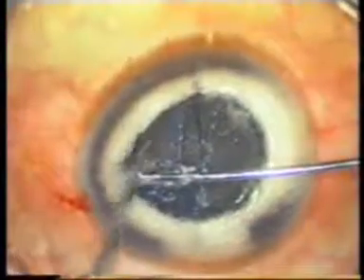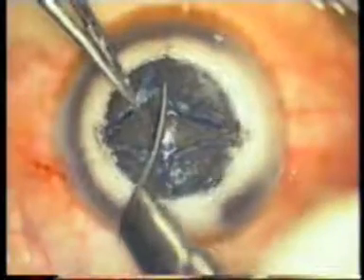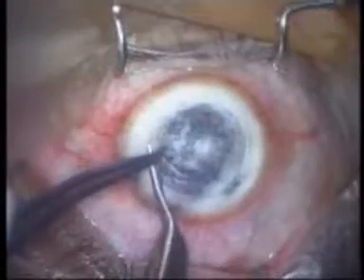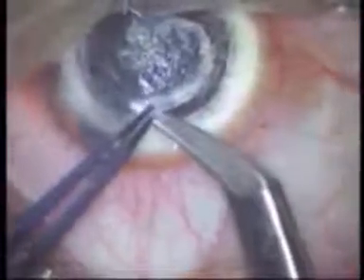The layers are incised by scraping with a sharp knife held parallel to the spatula. When one or more cuts into the remaining stroma are completed, the deepest stromal layers are circularly excised with blunt-tipped micro-scissors. In our modification, we use routine corneal scissors to create a spiral track of lamellar dissection along the edge of the trephine mark, with periodic trimming of the stromal tissue until the pre-Descemet's plane has been entered. Once the desired plane is entered, the stroma can be gently tented up with forceps and cut along the trephine mark using blunt-tipped corneal scissors.